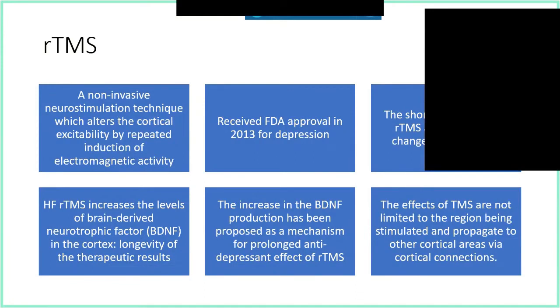TMS is an innovative research technique and is very attractive and popular in neurosciences at this point. And we know that transcranial magnetic stimulation alters cortical excitability, and the effect on the cortical excitability depends on the type of stimulation that you're using. Essentially, with high frequency stimulation, you increase the excitability, and with low frequency stimulation, you decrease the excitability.